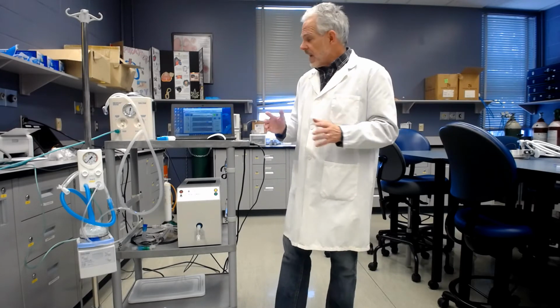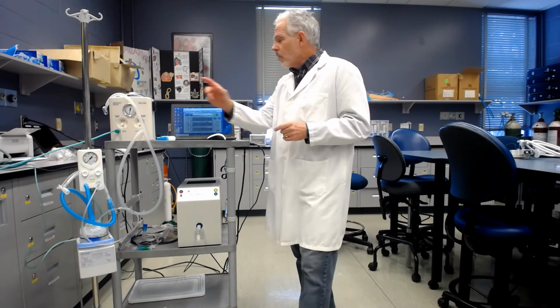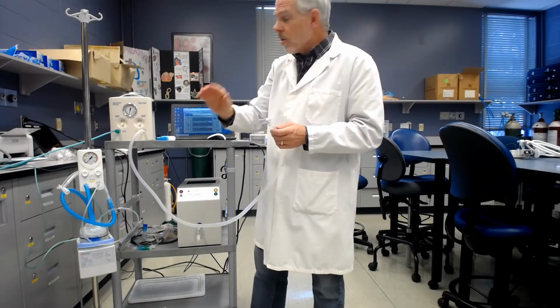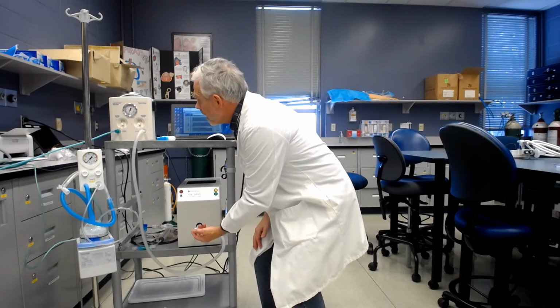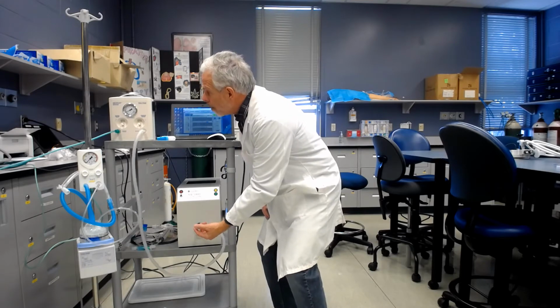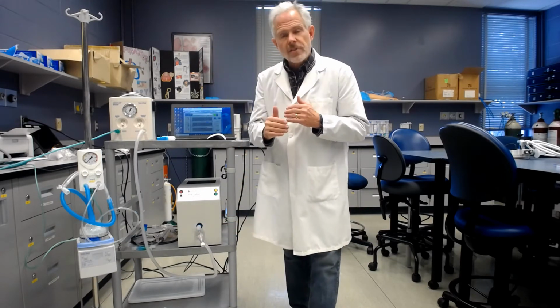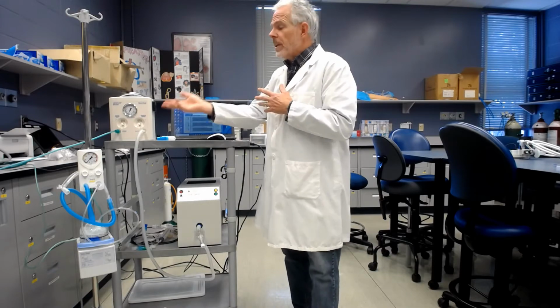So I'm going to have a standardized case here where there's nothing attached, and then I'm going to attach, as I've got set up here, 10 liters per minute of air going into the Neopuff, and then I'm going to hook it up and allow the ASL to spontaneously breathe through the system, and then I'm going to create positive pressure breaths at 20 centimeters of pressure over 5 centimeters of pressure. And I'm going to show you those graphs and describe what my findings were by doing this comparison between the two.